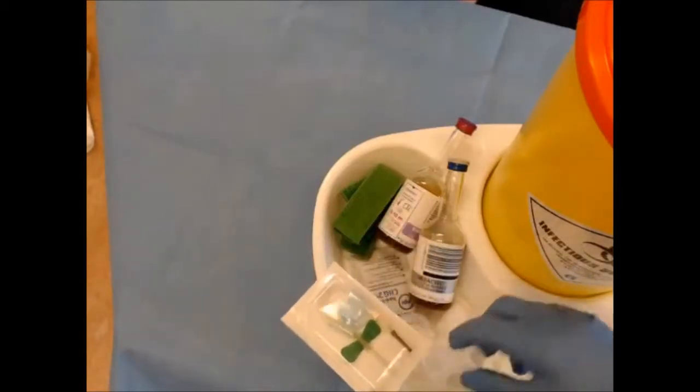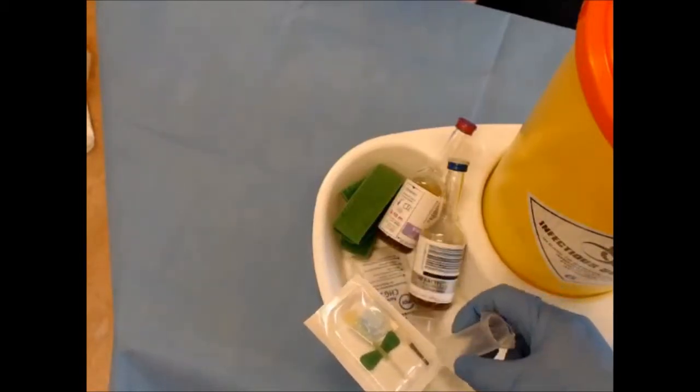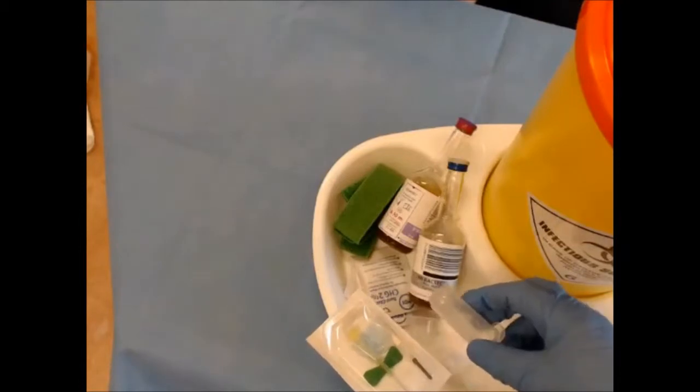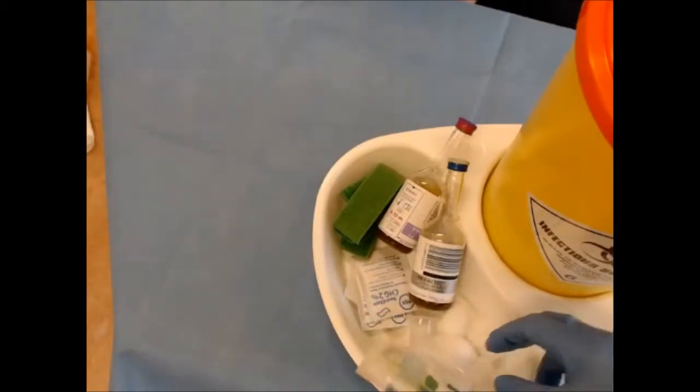You will need a needle of some description. We're going to use a butterfly with a vacutainer, which is very handy when you're doing blood cultures. But you could use a regular vacutainer needle.